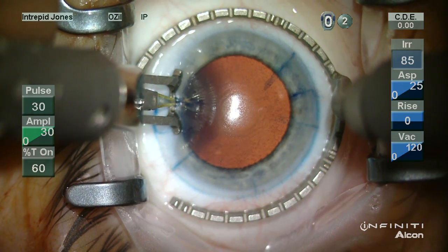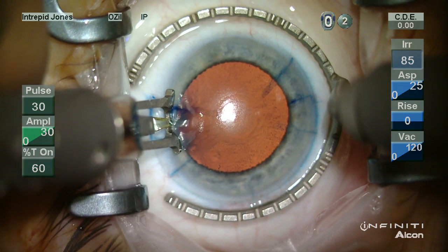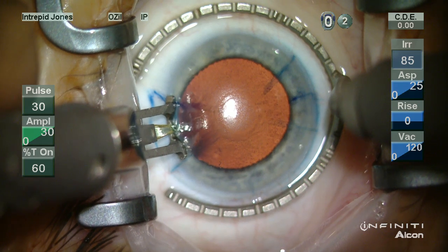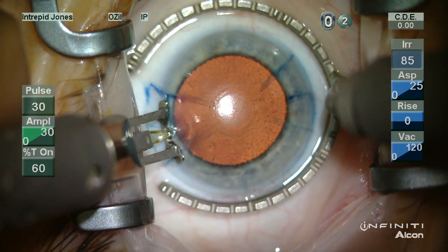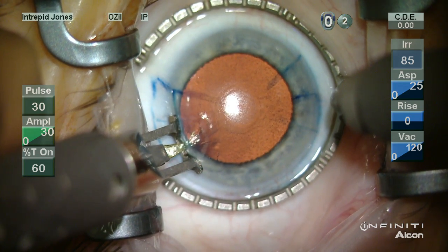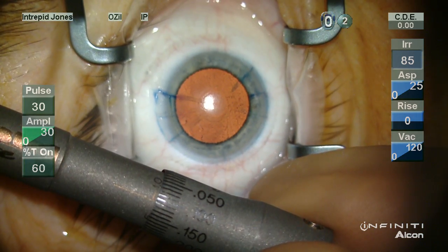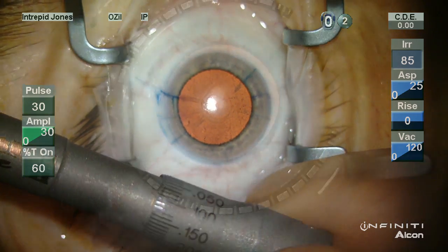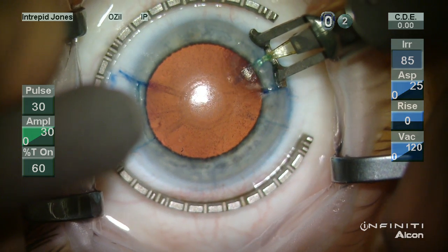Here a fine Thornton ring is used in a more freehand technique at about a 9 to 10 millimeter optical zone. The epithelium here does want to lift slightly, so in this example I'm lifting the blade out of the LRI site and then replacing it back down. This helps the epithelium settle down in the region that's wanting to lift and reduces tears, which are uncomfortable although generally well tolerated.